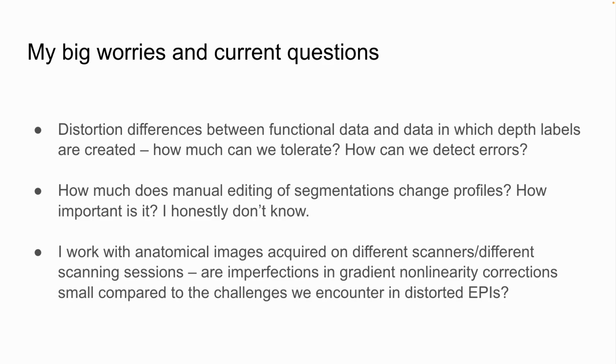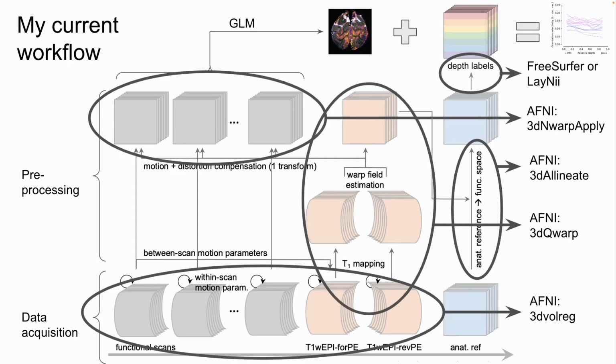I guess I want you to look at the data files that I have shared and come to your own conclusions about that. I'm in the process of writing up this pipeline just as a methods paper, so it's documented out there somewhere, and so I can get another line on my CV. And I'm playing around with comparing, because in this scanning session, and I did share with you in the data set that I shared, there also is a reverse phase encode functional data set.